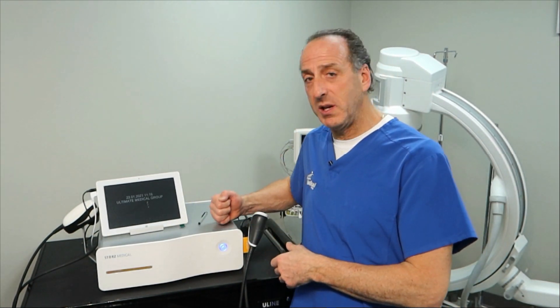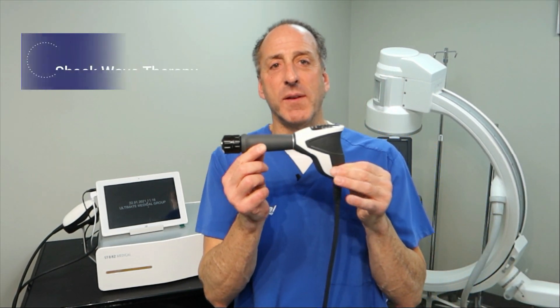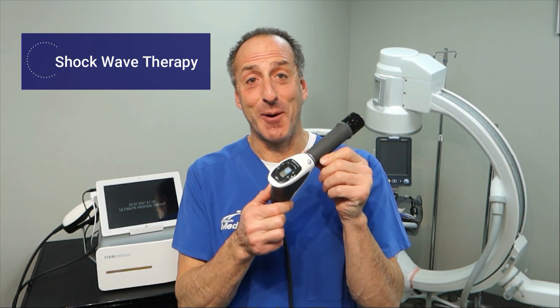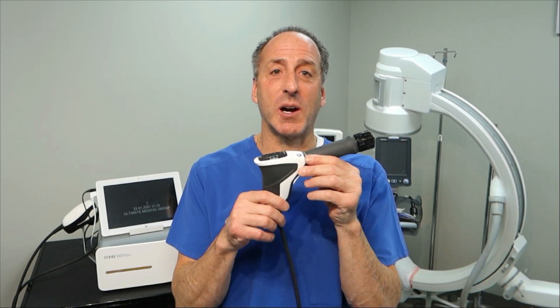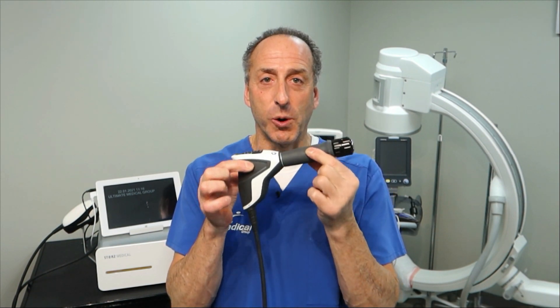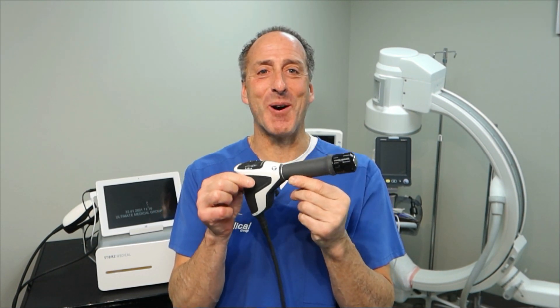Hey there, it's Dr. Kamisa. Welcome back to our video series. Today we're on the lab side of the office and we're introducing for the first time some new technology called shockwave. It's my new gun. Wait till you hear about this. So today this is shockwave therapy. I'm going to explain how the instrument actually works and why we're so excited about this.